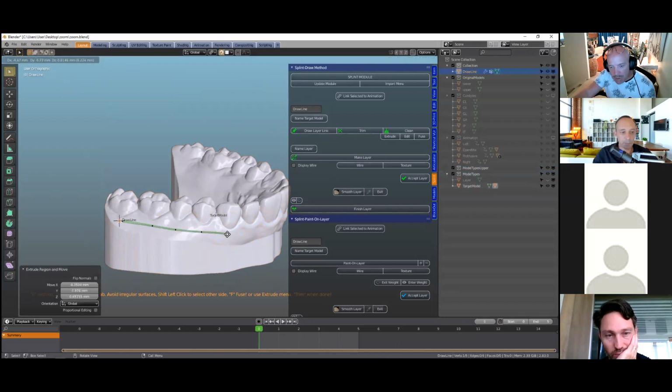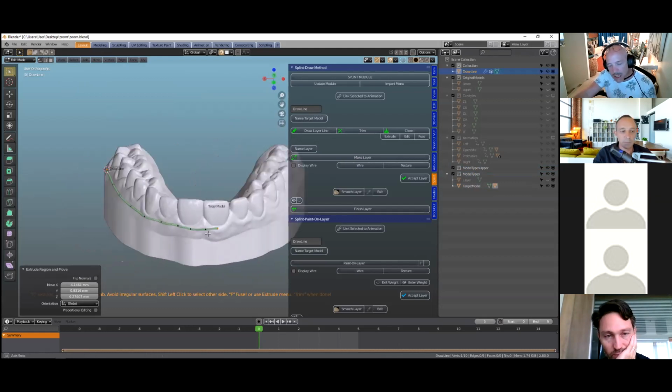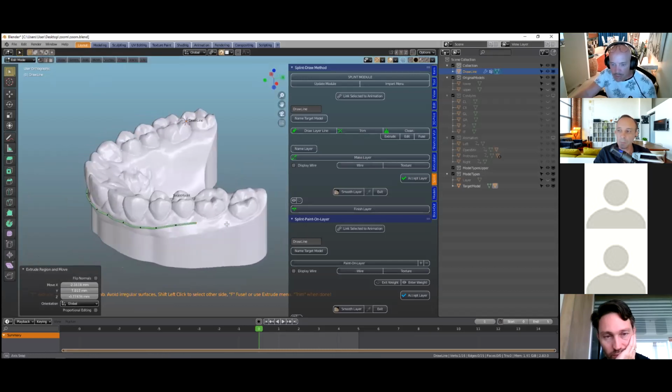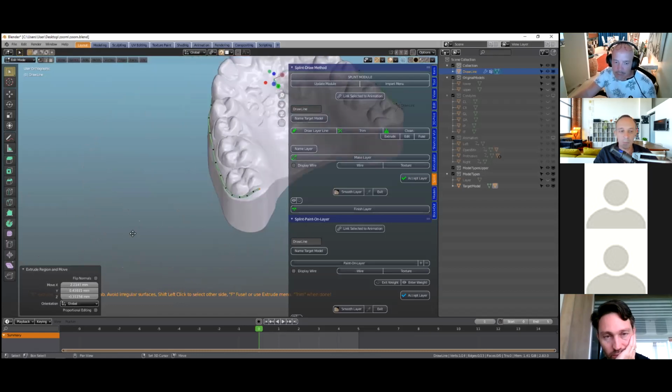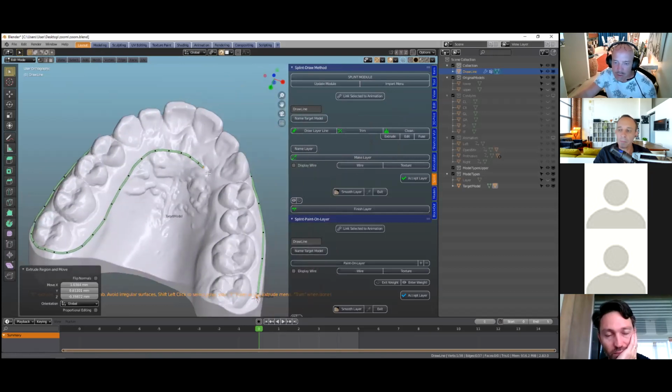And remember how I said that we should keep this to maximum. No use going up a third on the incisal edge, because when the patient sleeps at night, this thing is going to just pop out when they do anything. A bit of thought there would go a long way, I think. So this is what we do with the suck down splints as well anyway. Very often they go all the way, the hard soft material we use in the lab.